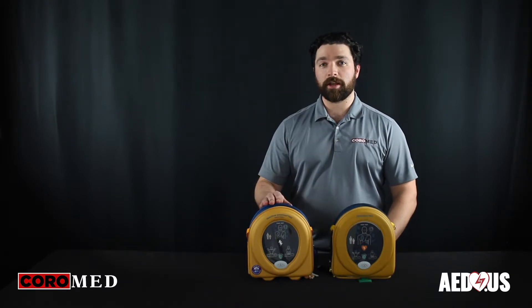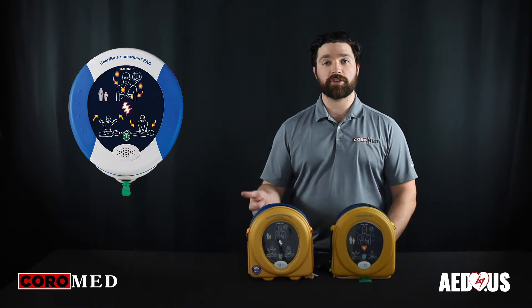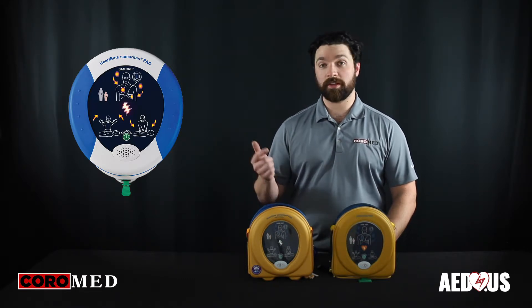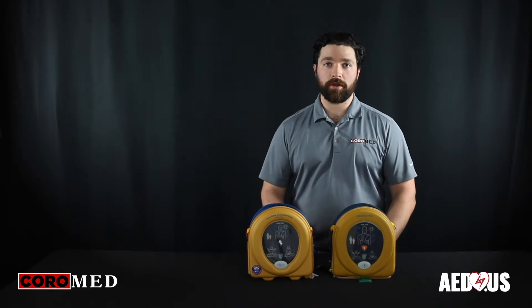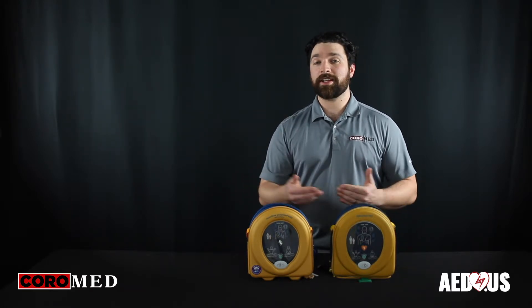The fully automatic 360P will advise you that a shock is needed, then tell you not to touch the patient, and it will deliver the shock on its own. This cuts out a step in what is undoubtedly going to be an already chaotic situation.